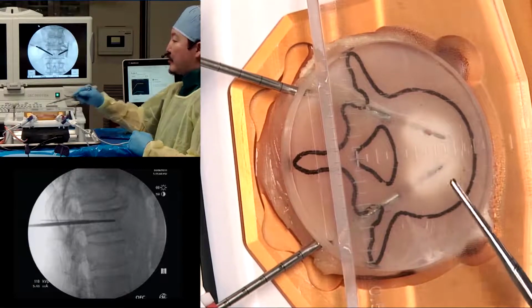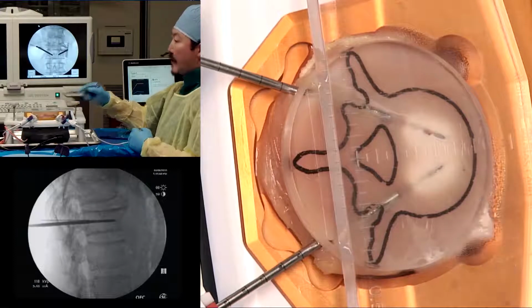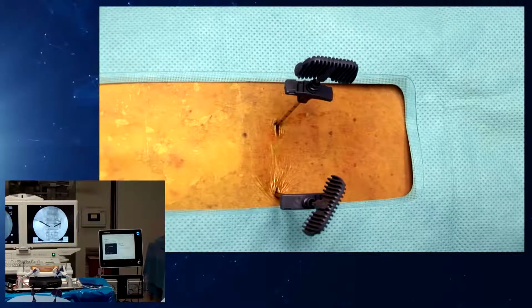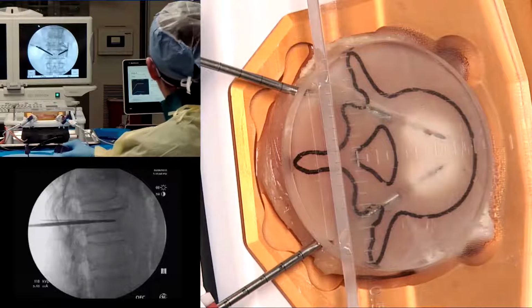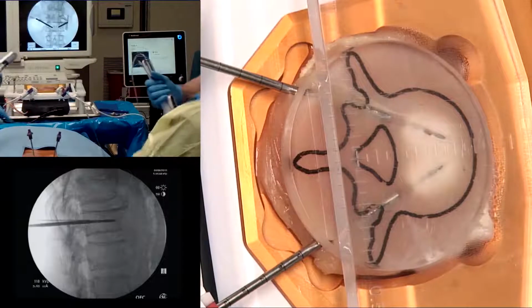And this has been shown to actually help with tumor pain as well. So once you've done this RF probe, then you can jump straight to the balloon, and then finally to the cement augmentation here. So we'll go back here. We'll assume that we did the full 15 minutes. We'll take out our drills, and then we're going to take our inflatable balloon tamps.